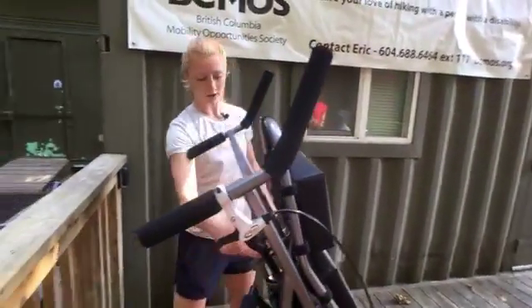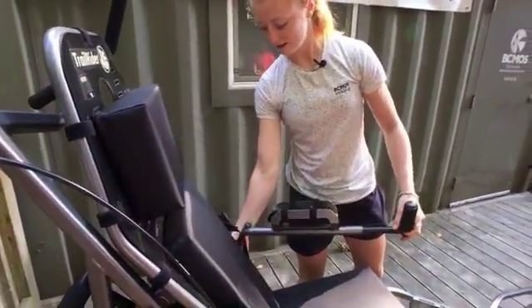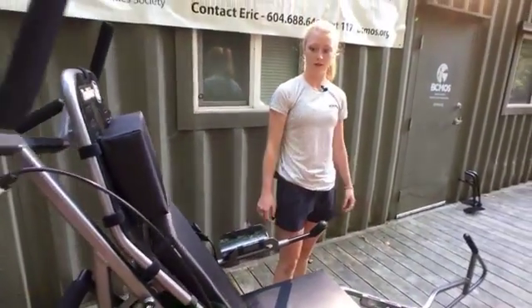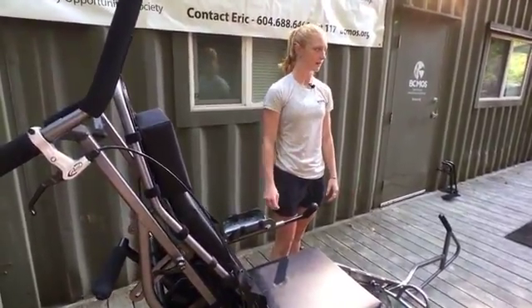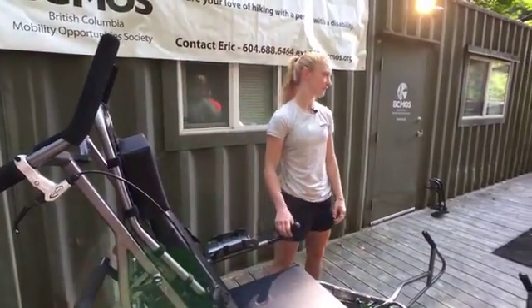So I'll start by just putting one on here, and that way Eric can still get in on the other side. But that will help just stabilize him once he's in the Trailrider. And then also show you all the adjustments once we get him in there, so we can make it a little bit more comfortable for you as well.